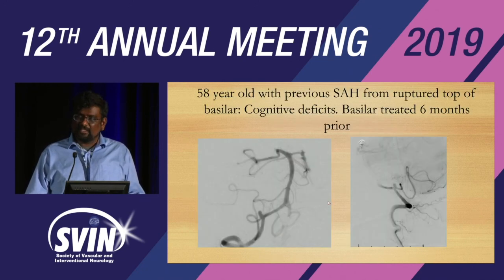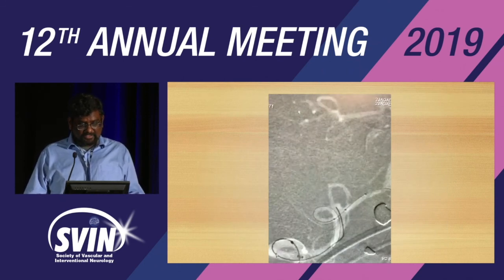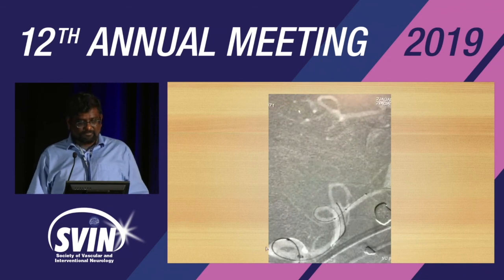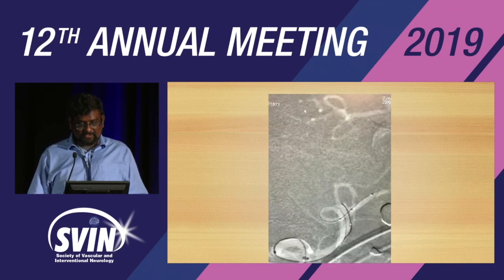Thank you. And then this is an unofficial part that I threw in just to give poor Todd a heart attack. So there's a right PICA aneurysm in that same patient. So this, I just wanted to play this because it's very illustrative of how I use the balloon. It will only take like 1 minute. So here we go. We are tracking the VIA21. This is a tiny aneurysm.